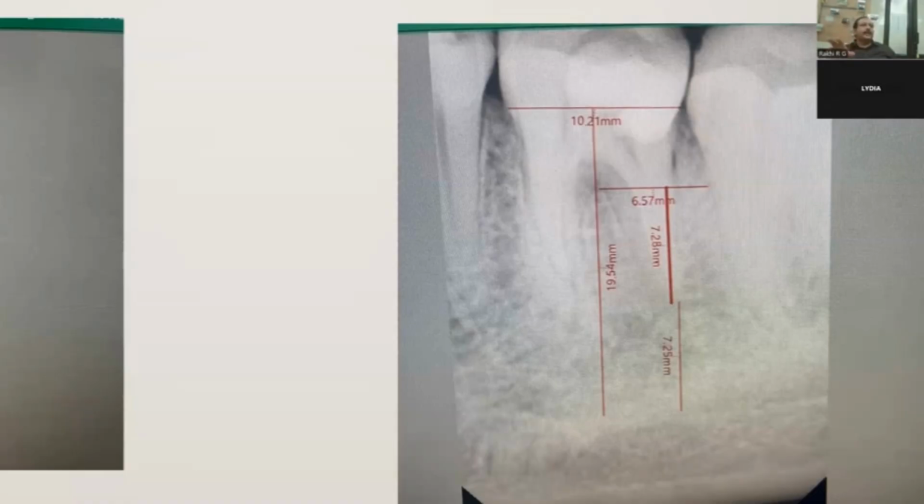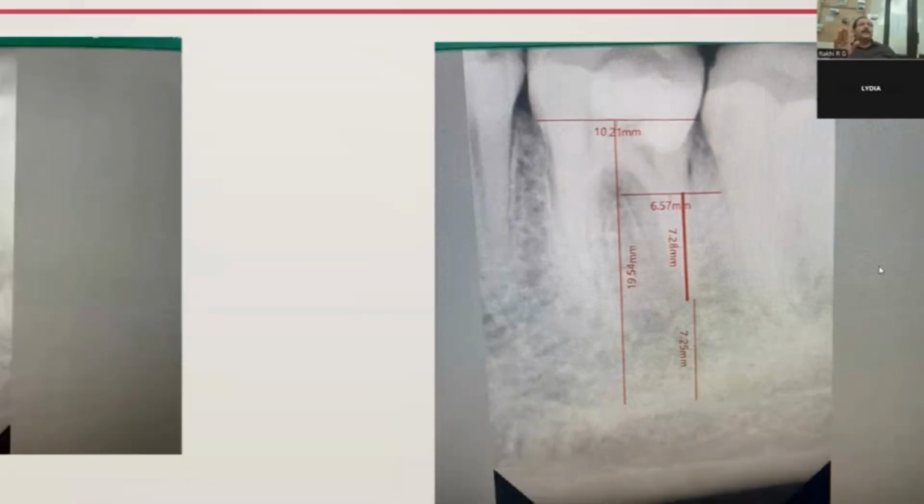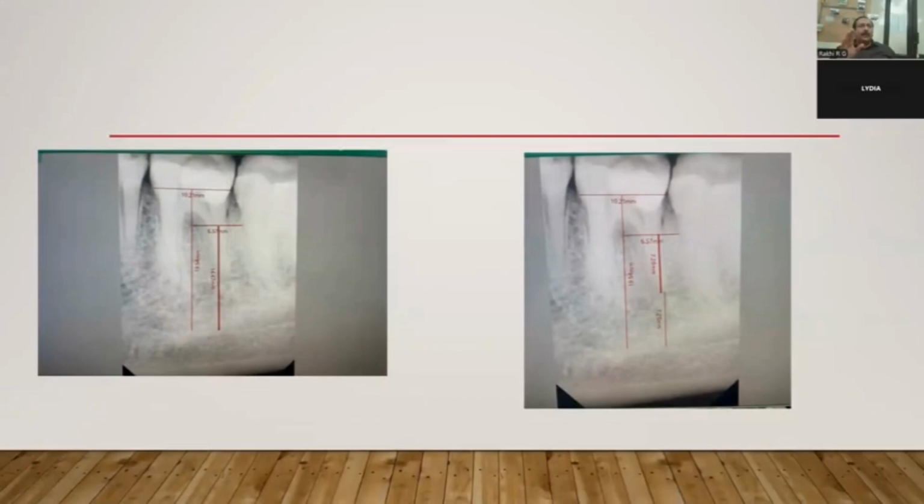So considering all those things, section it, remove it, see the bone, evaluate it. Anyway, you have to open that area. So a sulcular incision of 7 and 6. Open that area, see for yourself, section it, take it out, section that particular area in such a way that you will not have any projection of the fragment of tooth that is retained. You should not have a projection of the interradicular area of the crown. Do you understand what I mean to say?